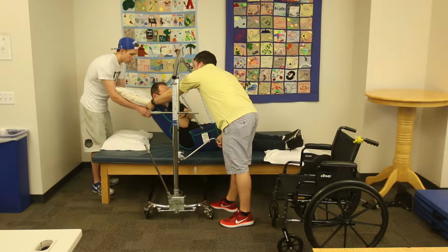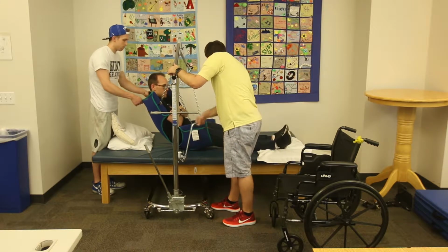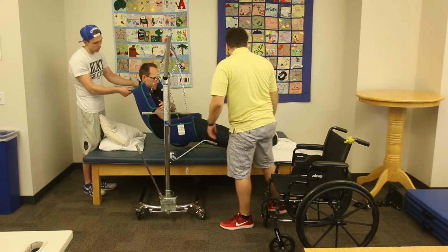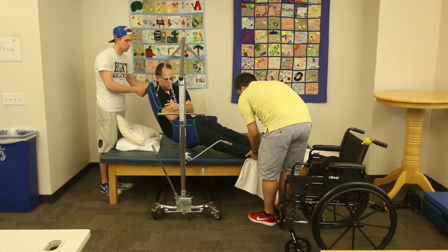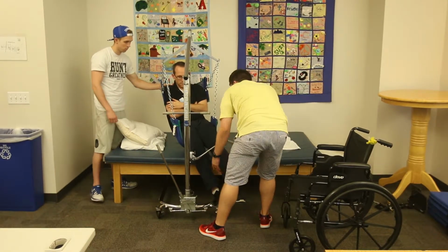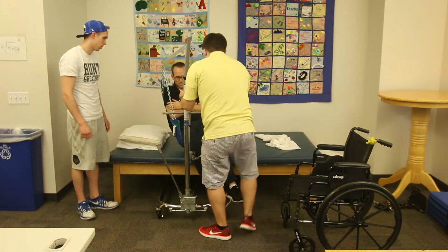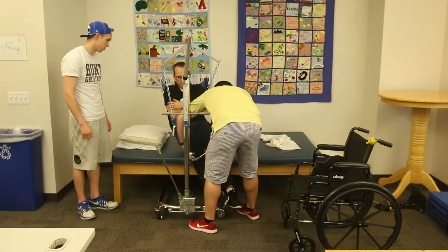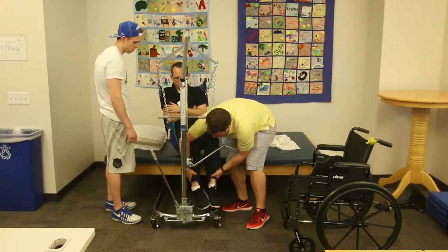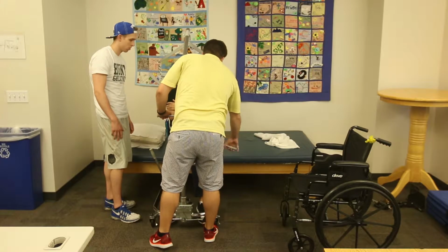Try to grab behind and just pull this sling up towards the shoulders. Make sure that he's sitting in there nice and snug. How you feeling, Lucas? Good. And make sure that you're off the table. You're gonna swing your legs around here. Gonna take those locks off and pull you out slowly. Bring your legs around so that you're facing me. How you feeling? Good. All right.